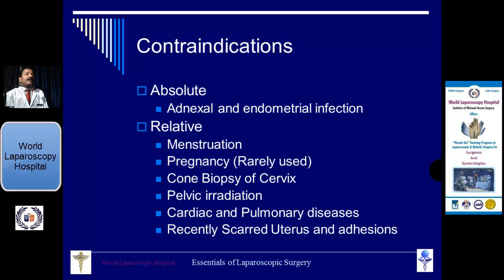Although in the book it is written that it is not necessary, because the baby will come with the copper T in its hand, so you may not need to remove the copper T. But why remove it? Because psychologically sometimes they don't tolerate it. And in 50% of cases, if you do hysteroscopy carefully, you can take the copper T out without abortion, especially in the early stage. So this is an indication.